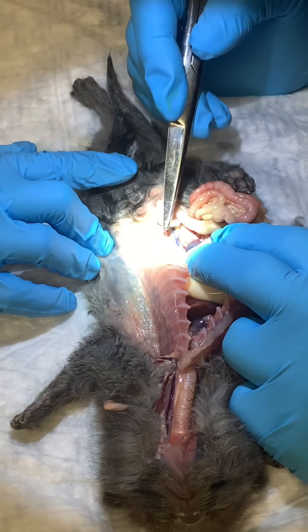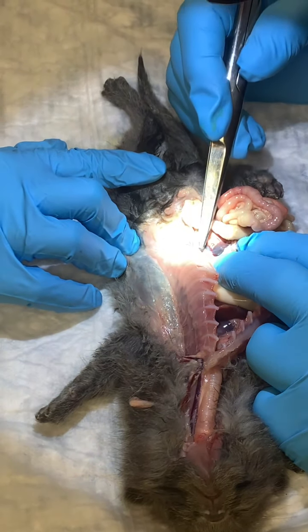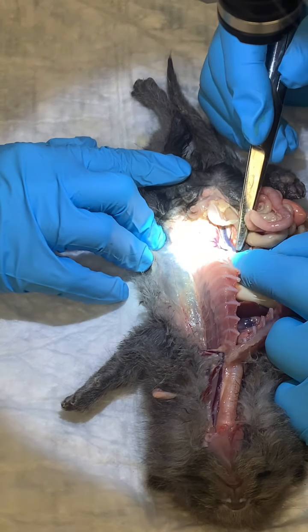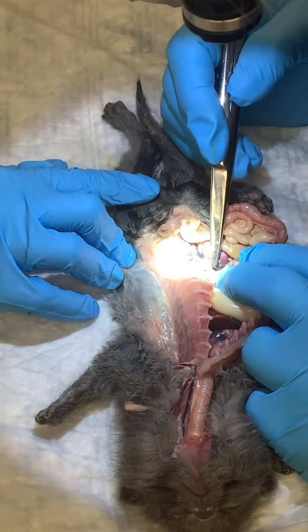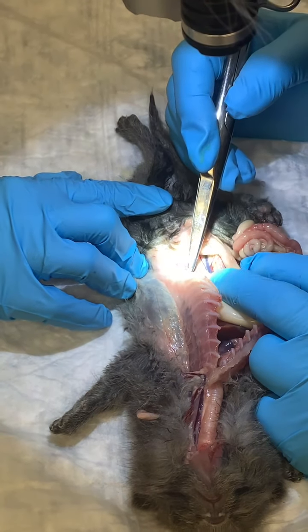So there's the aorta and the vein. And then there's the kind of the shepherd hook appearance. And is that the, there's both kidneys.